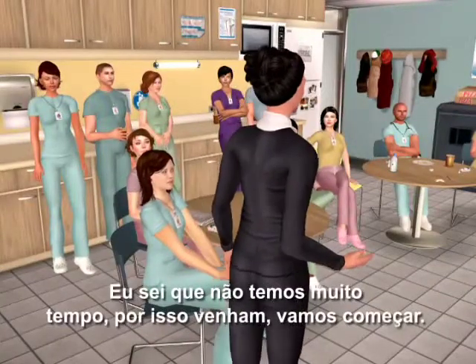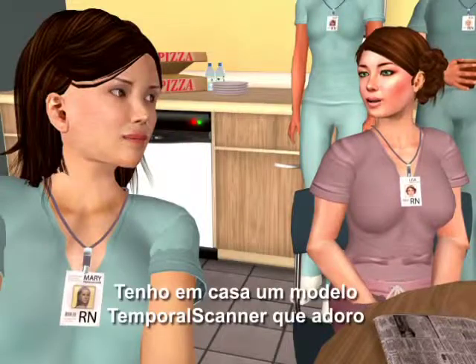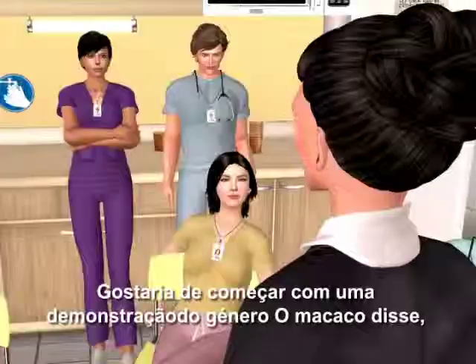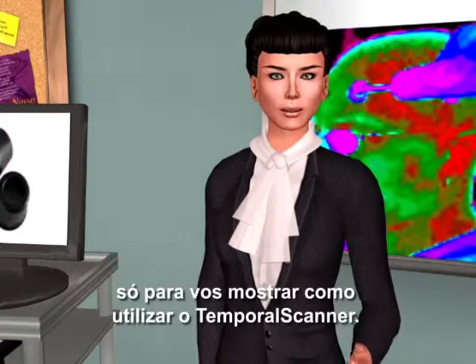I know we don't have much time, so let's get started. I've heard about these — I have a home model temporal scanner that I love, and with three kids, I use it all the time. I'd like to begin with a Simon Says demonstration, just to show you how to use the temporal scanner.